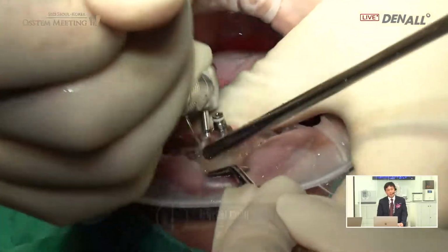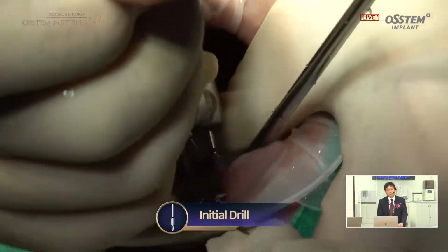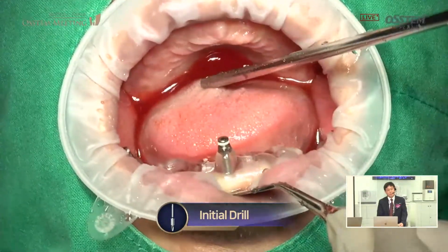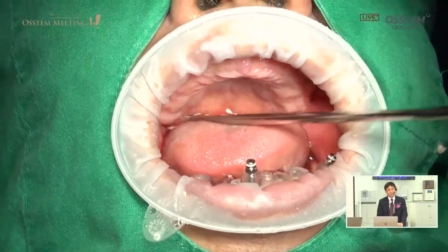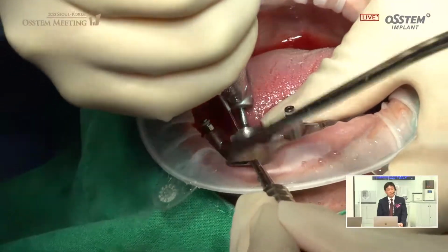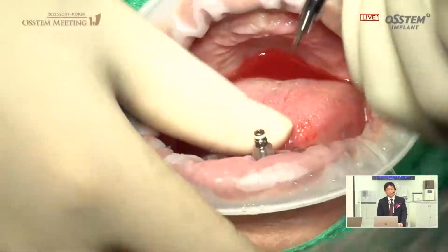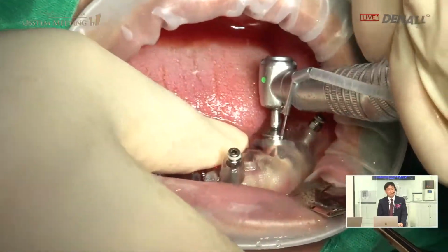Initial drilling is done. Because it's the lower jaw, primary stability is very important today. I'm going to use the soft initial drill first.